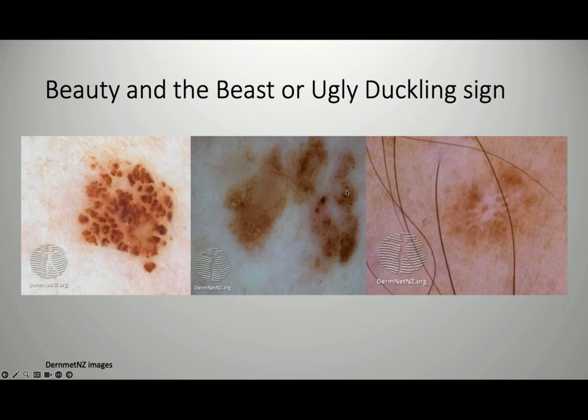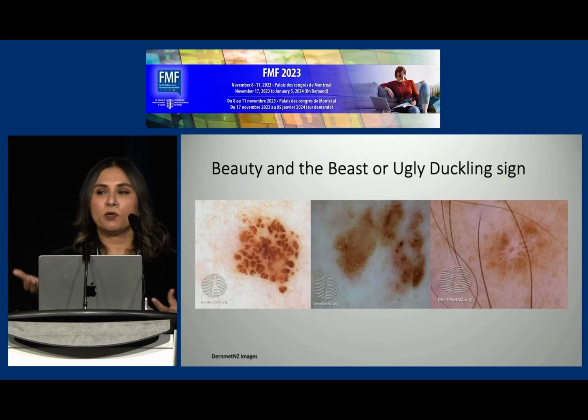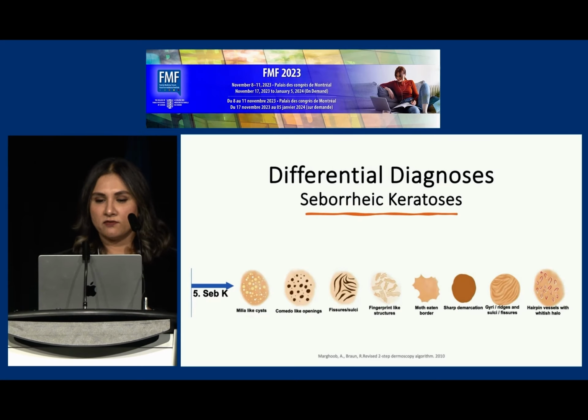And you may ask, okay, once we've mastered the 3-point checklist, what's next? The 3-point checklist we chose because it gets you into the realm of dermoscopy and getting comfortable with it. But we're all people that recognize patterns. So once you start using your dermatoscopes, you'll start recognizing patterns. And then the next step will be, okay, now I need to know what are the differential diagnoses for pigmented lesions, and I need to know the structures that make them what they are, and then you'll start recognizing those, and that's how you expand your understanding and your knowledge of dermoscopy. So to start off with, use the 3-point checklist, and then you delve into differentials.